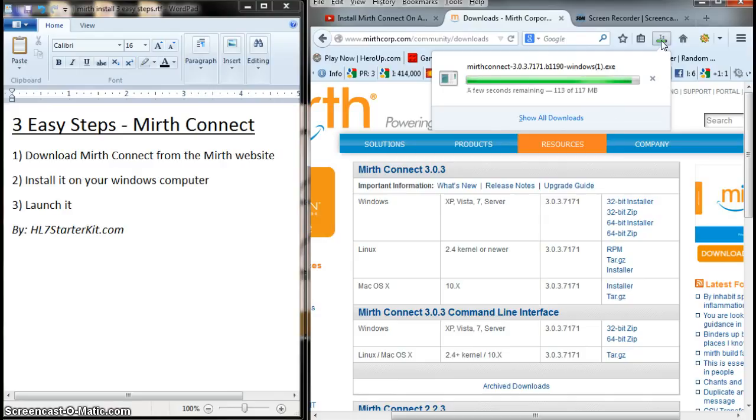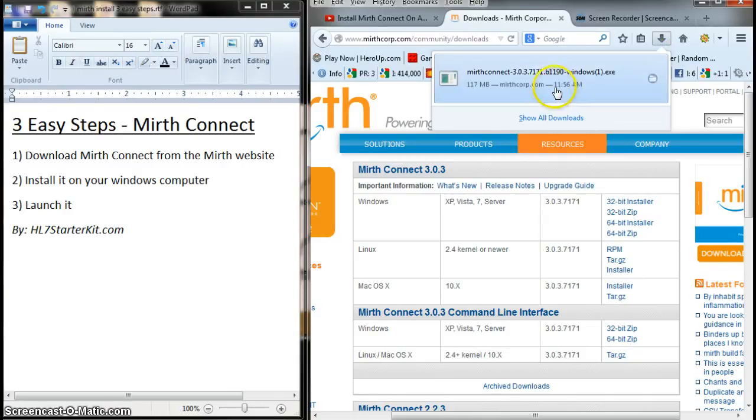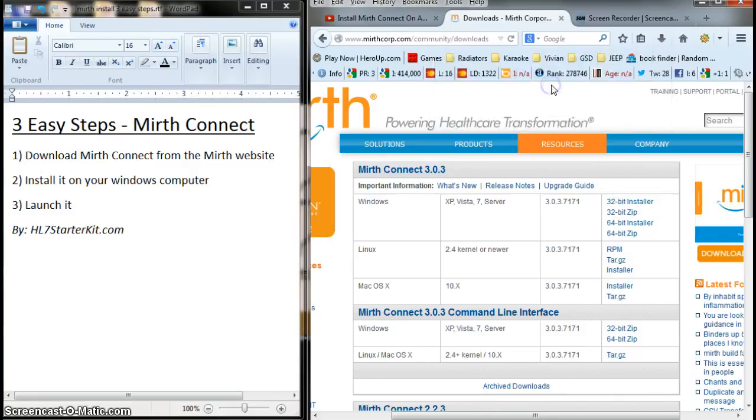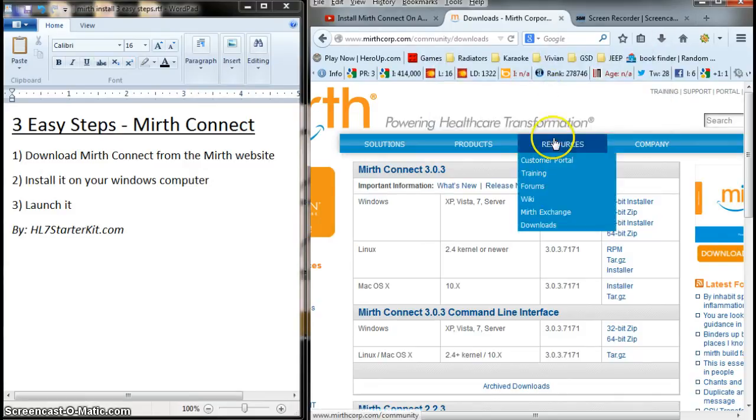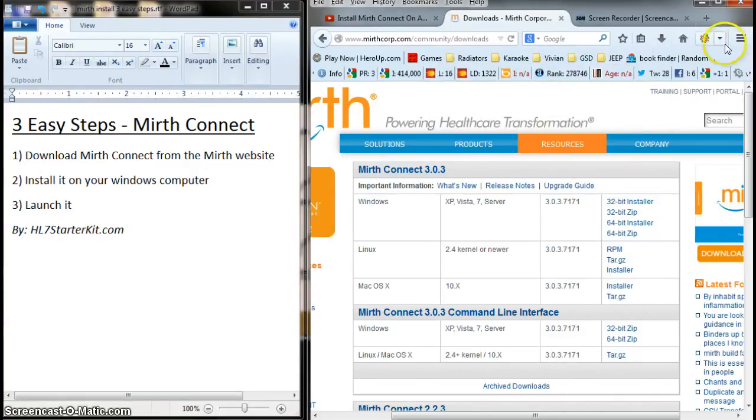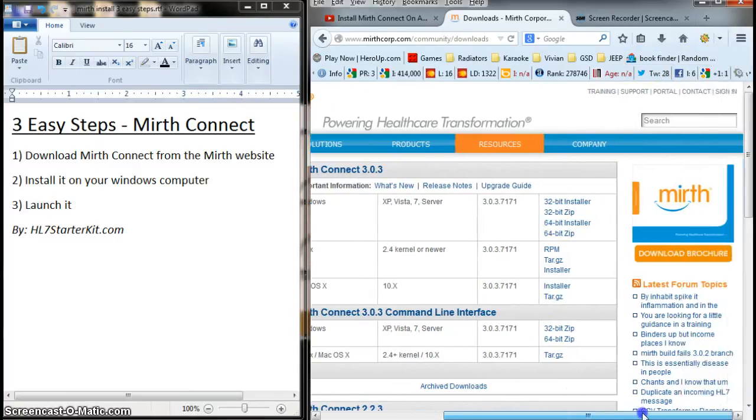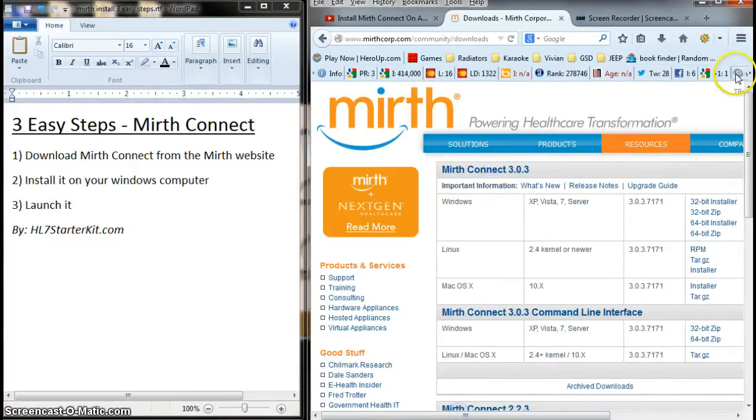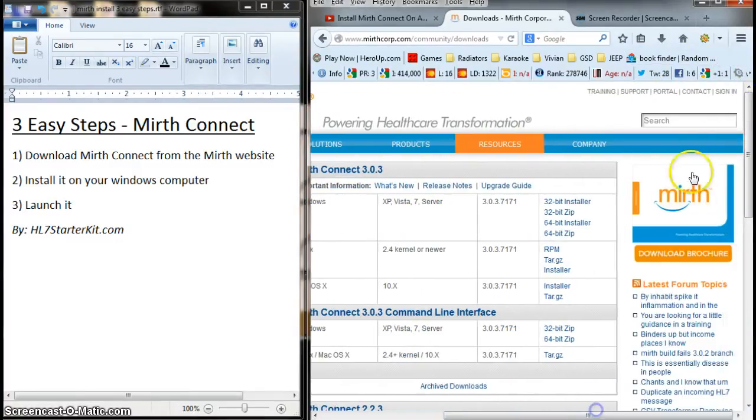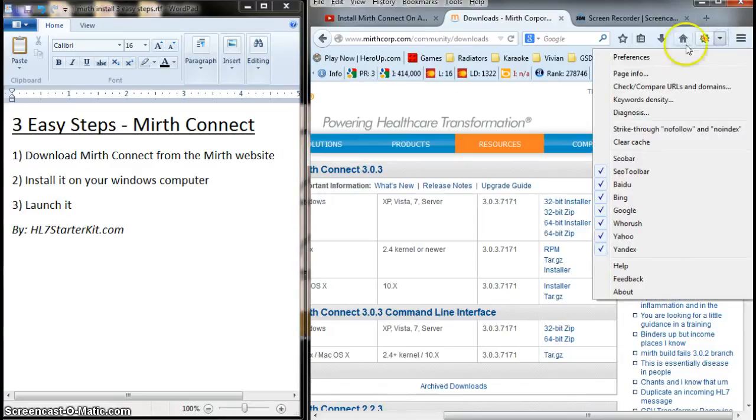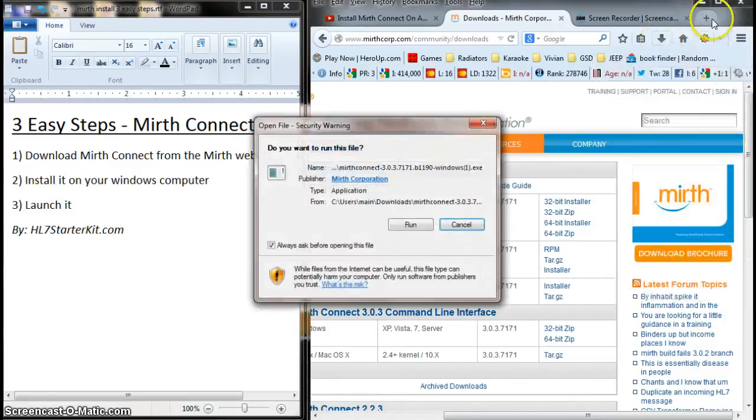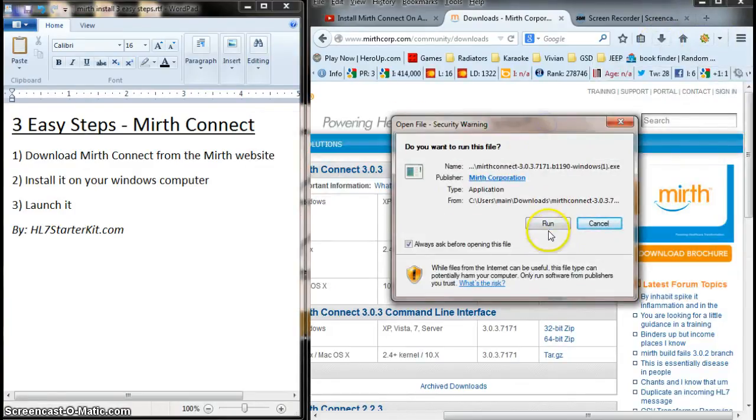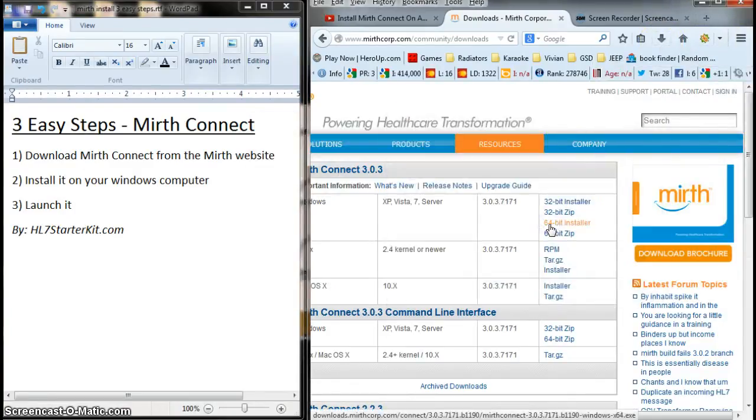And here we go. Almost done. And here we are. I can just click it right from here. There it is. I click Run.